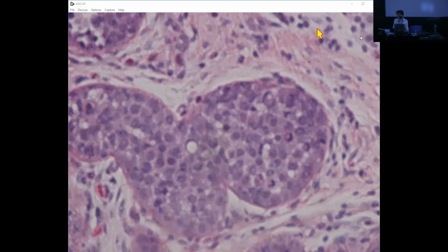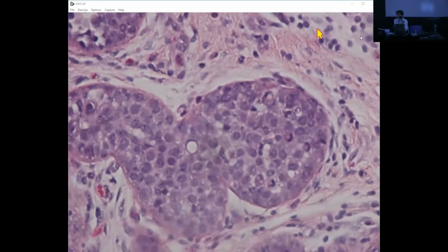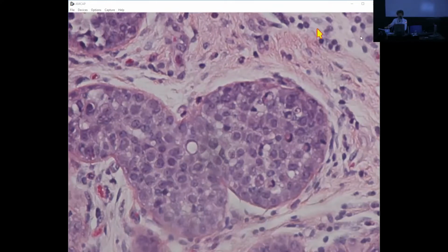Now, it was interesting to see that the terminology used in the WHO classification was first introduced by Haagensen ages ago, a long time ago. And then it was kind of abandoned. Nobody talked anymore about type A or type B cells, but they kind of revived the use of this terminology. And I think it makes sense, but it's not reported. We just report this as classic lobular neoplasia, and that's it. So do you use type A, type B? No.